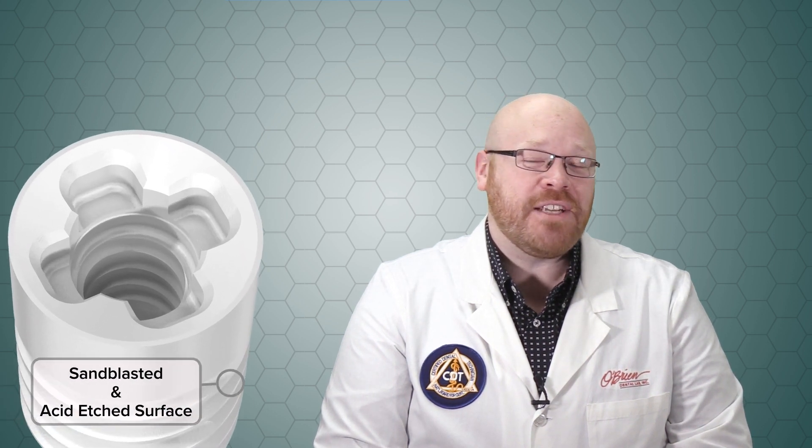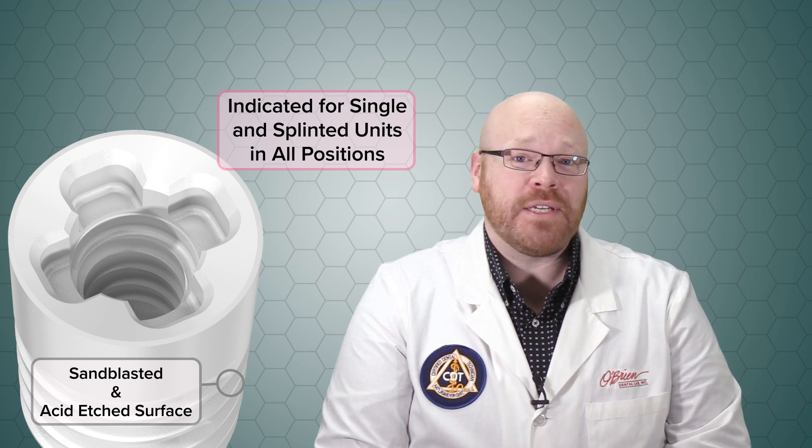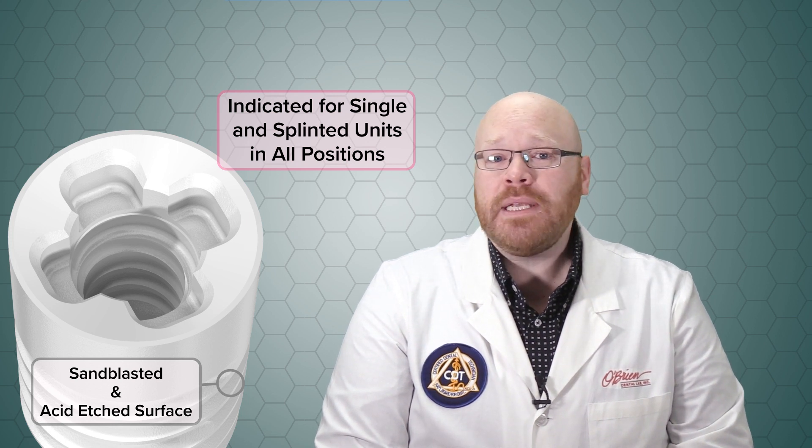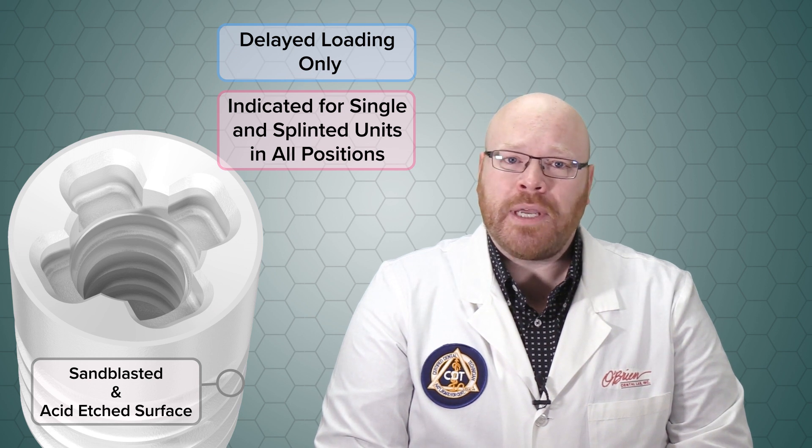The Nobel Pearl implants feature a sandblasted and acid-etched surface and are indicated for both single and splinted units in all positions. The implants have been engineered to achieve primary stability, but they're really intended for delayed loading only.